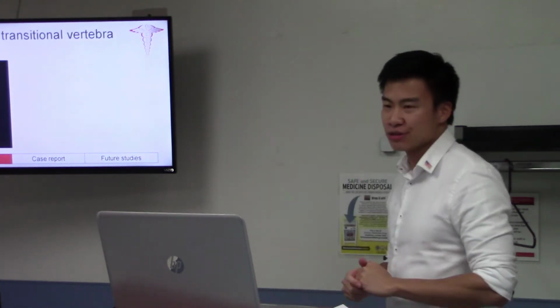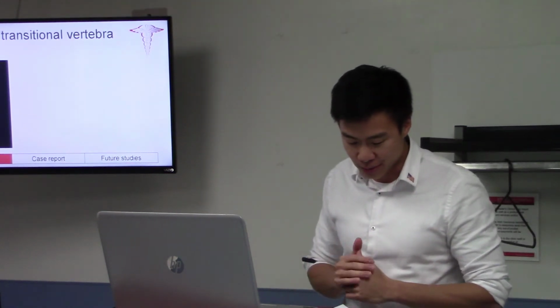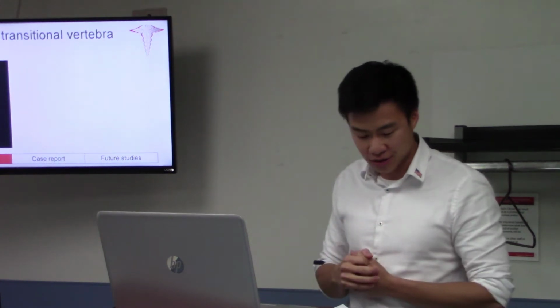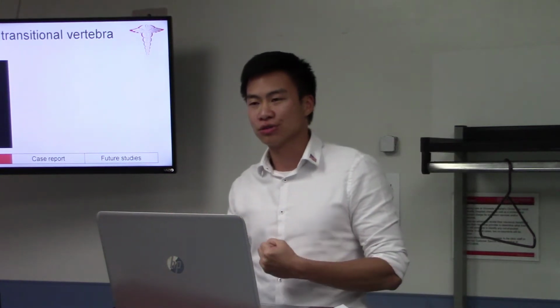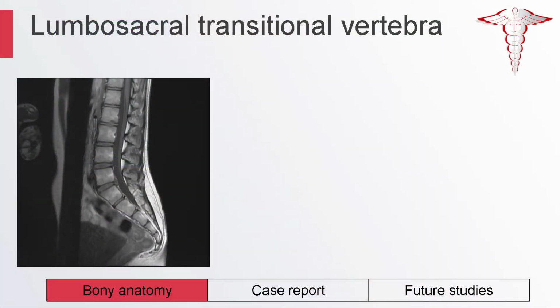One of the difficulties of looking at coccyx X-ray is determining how many segments make up the coccyx, and so you know where the sacrococcygeal joint is. So have a look at this image. It's a T2 MRI. What do you notice about it? I mean, the title kind of gives it away. Is there a transitional vertebrae? Yeah, there's an L6. So it's difficult to just tell from the lateral view. I have difficulty as well.